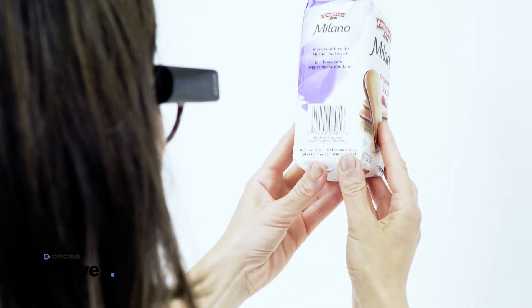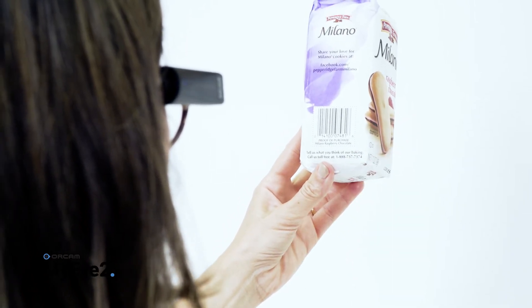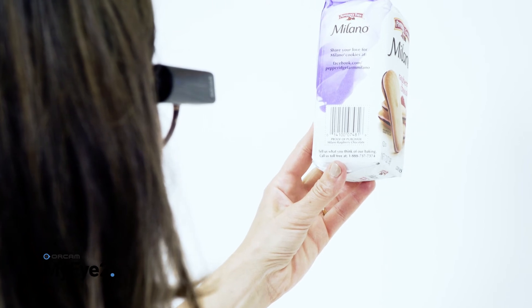In the automatic barcode detection mode, hold the product at eye level in front of your face. When the barcode has been detected, your device will announce the product information.